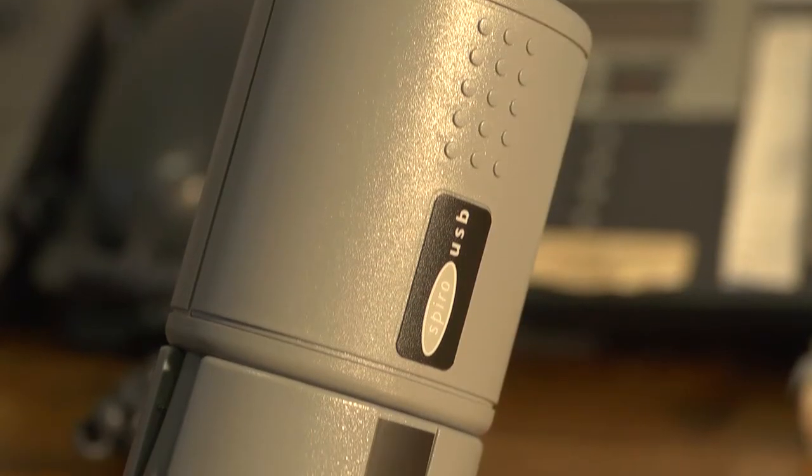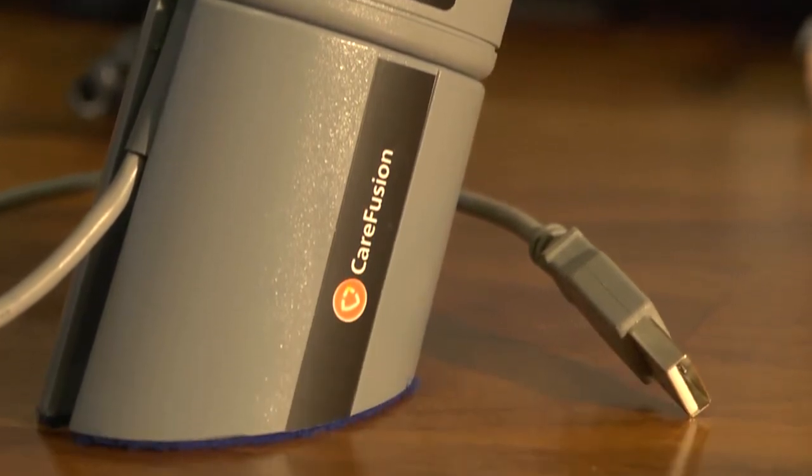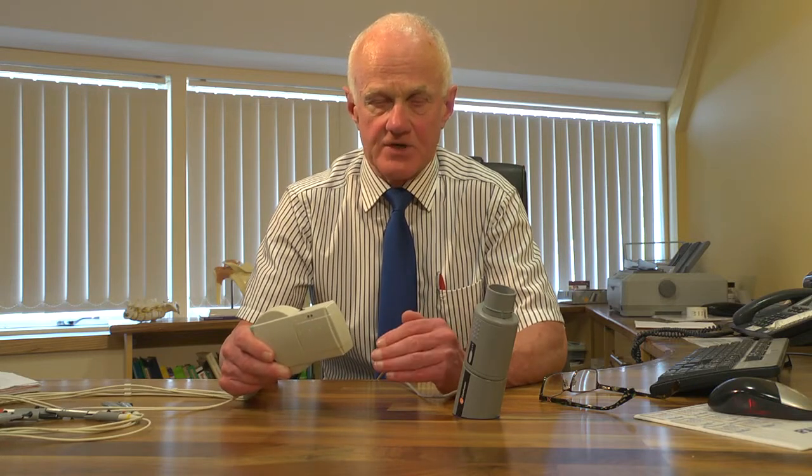So we have a custom-made Bluetooth device and we have a CareFusion USB spirometer device. We use these every day. So now, without further ado, we're going to demonstrate how to take the ECG, how to integrate it into the patient file in HealthONE, how to easily take spirometer readings for a patient, and how to integrate it very easily into the patient HCR.